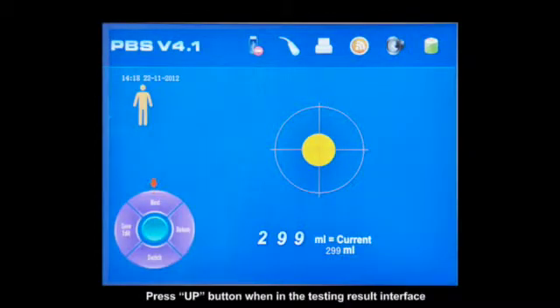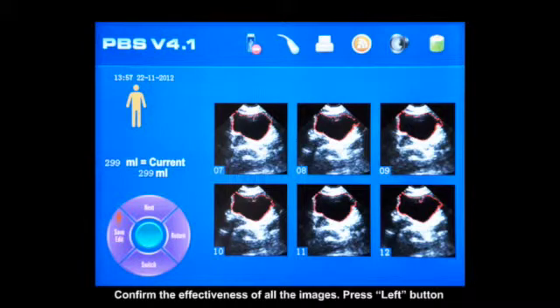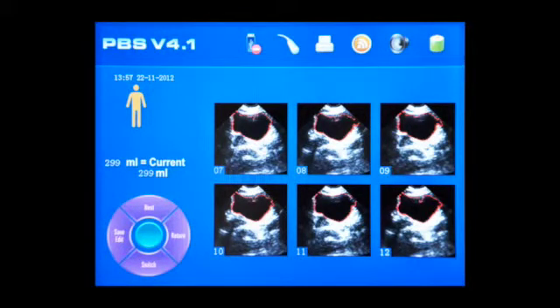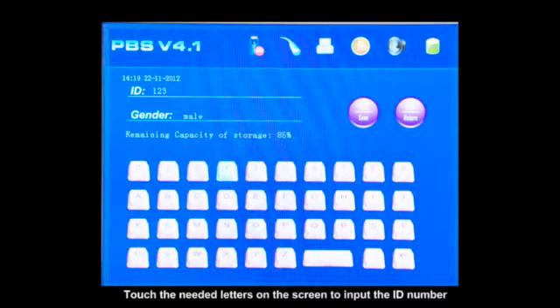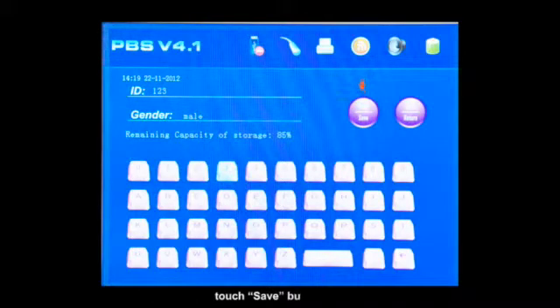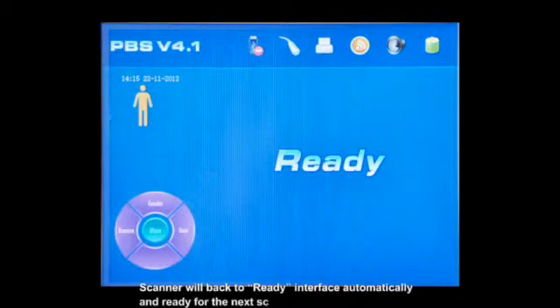Press the up button when in the test result interface mode to confirm the effectiveness of all the images, then press the left button. Now you can enter into the ID Edit interface to input the patient's identity. Use the touch screen to create your patient ID. If you make an incorrect entry, use the delete key. Then touch the Save button to save your data. The scanner will then revert back to the Ready interface and you're ready for the next scanning.